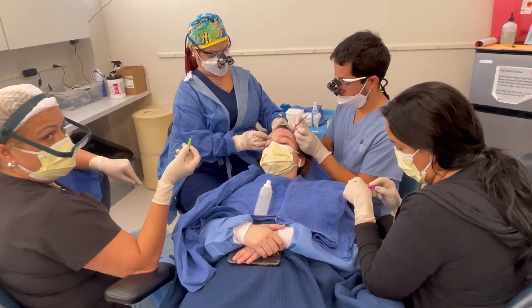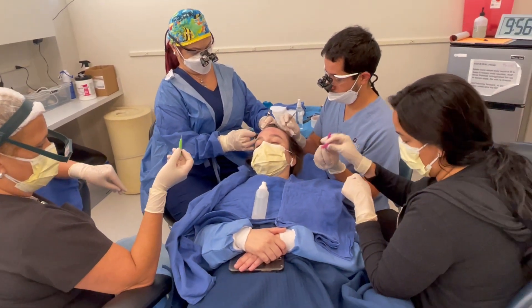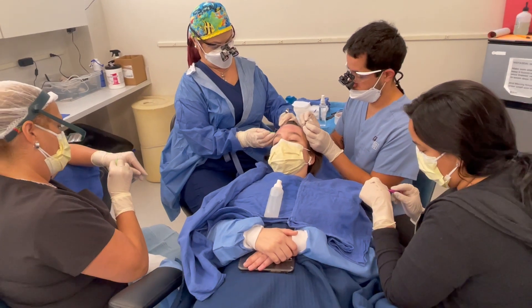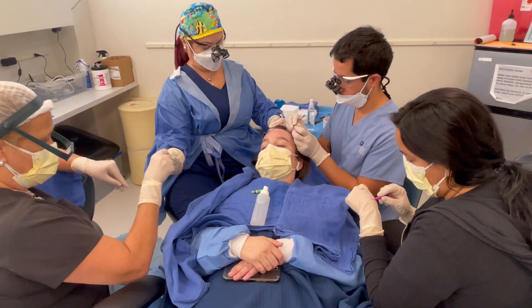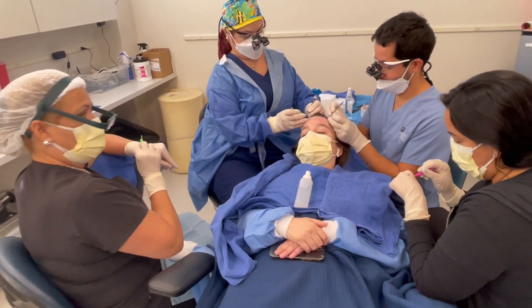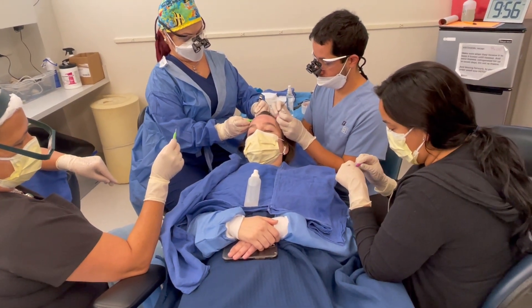What we're demonstrating here is the use of implanter pens. It's a four-person system — two people are planting into pre-made recipient sites, which were made by me. Jose and Carmen are going ahead and doing the planting — say hi guys. And you have Monica and Lourdes loading. It's really an all-steps system, and all steps require experience.